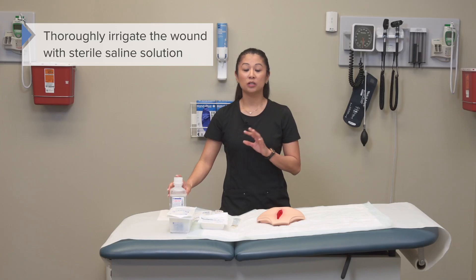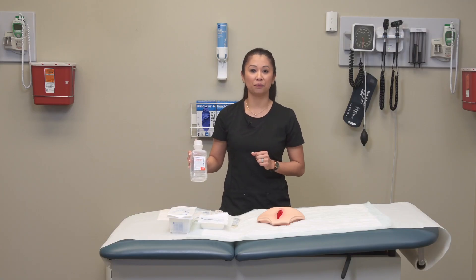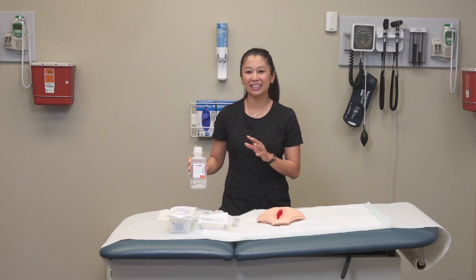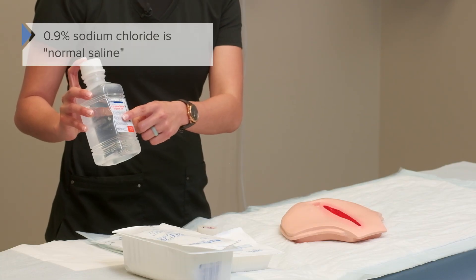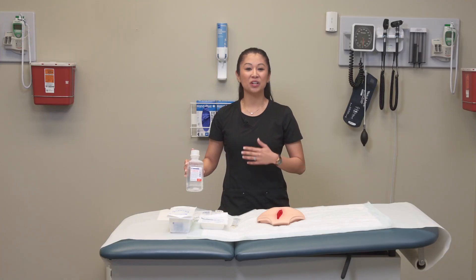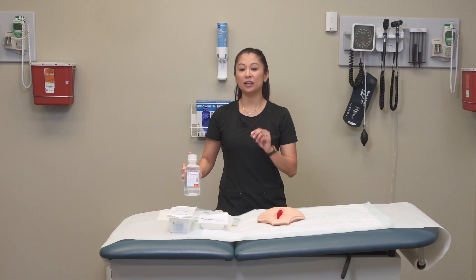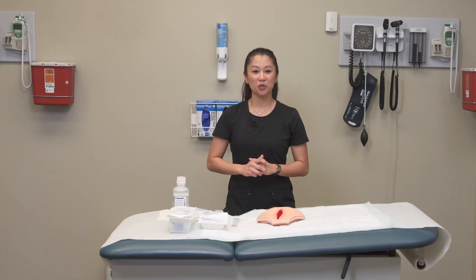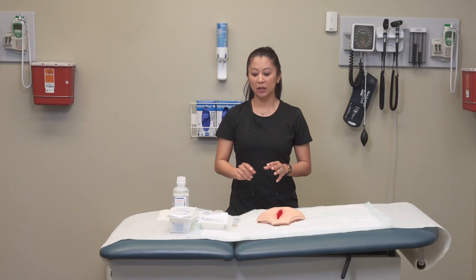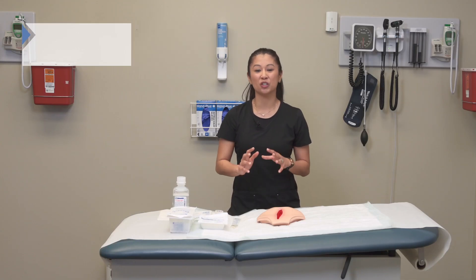The wound will often be cleansed per physician order, but many times we use sterile saline solution — that's 0.9% sodium chloride. It's also a great idea to have an irrigation tray with a container and syringe to pull up the irrigant fluid. Once you've irrigated, take sterile gauze and dab dry around the wound — we don't want extra moisture sitting on the skin.